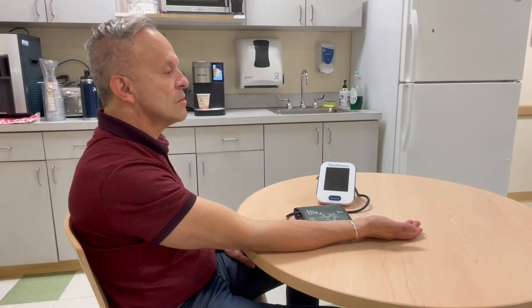You should sit in a chair next to a table. Your back should be supported and your feet should be flat on the floor. Your arm should rest at your heart level on the table next to you. Make sure that your arm is bare.